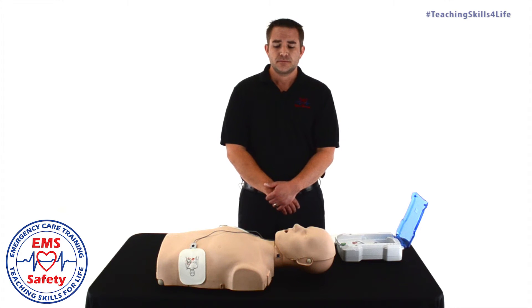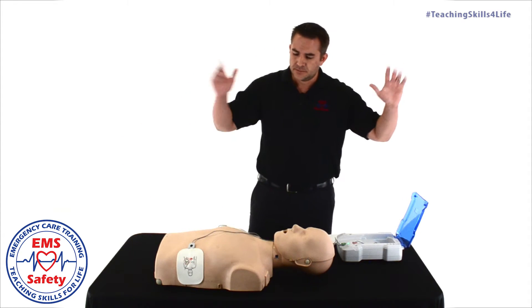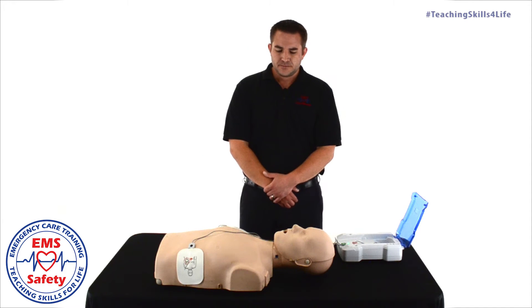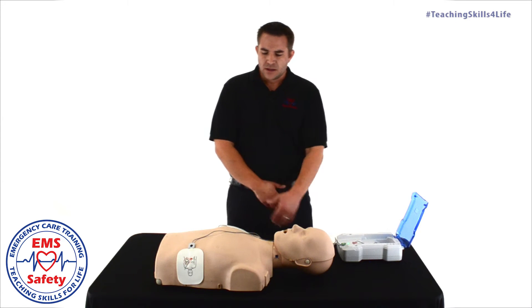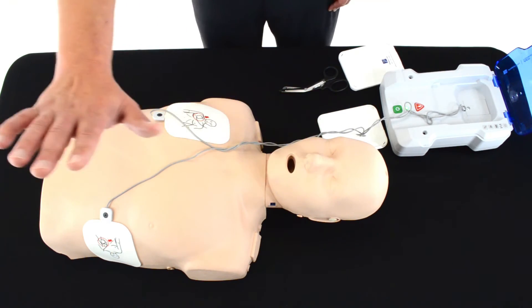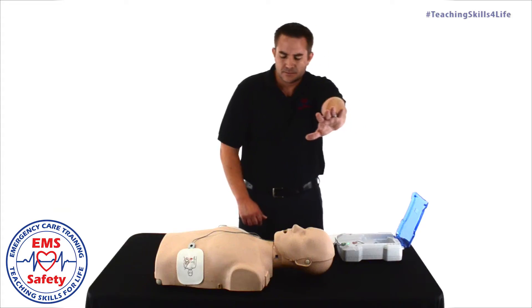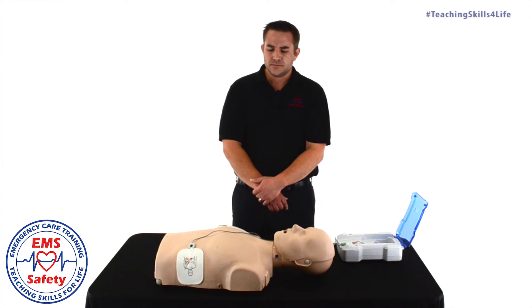Press pads firmly on skin. Do not touch the patient — analyzing heart rhythm. Shock advised. Everybody clear. Clear. Don't touch the victim. Shocking. Clear. Shock delivered.